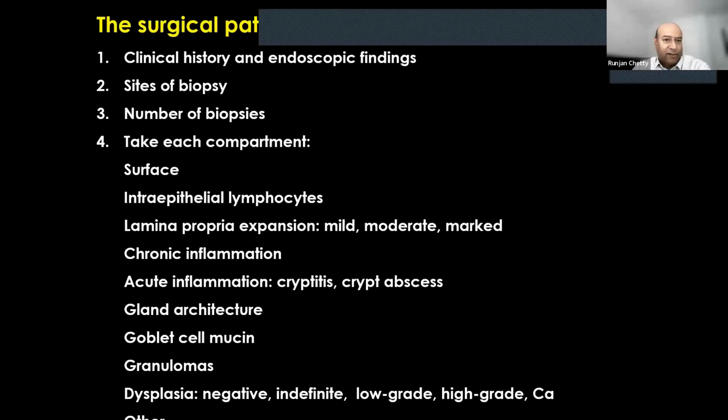Take note of the number of biopsies. Again, it's important to make sure that it correlates with what the endoscopist has said and tissue is not lost or not cut through, and you need to go deeper. And then your examination, of course, needs to be very methodical and follow a sequence, a checklist that I use.